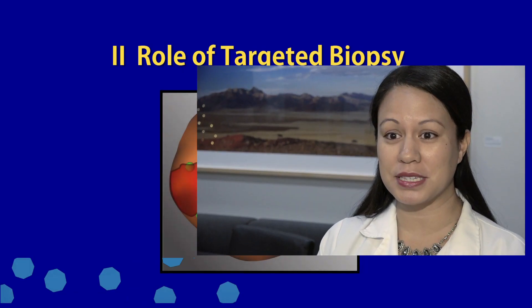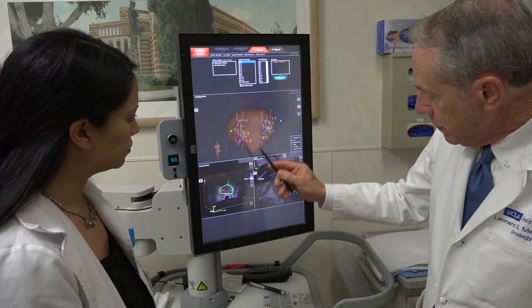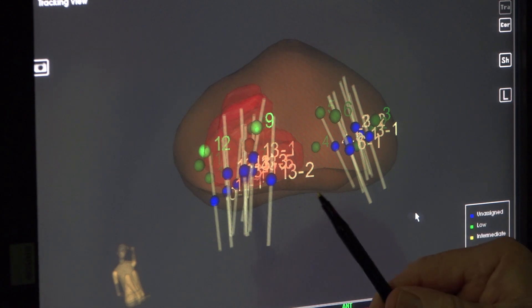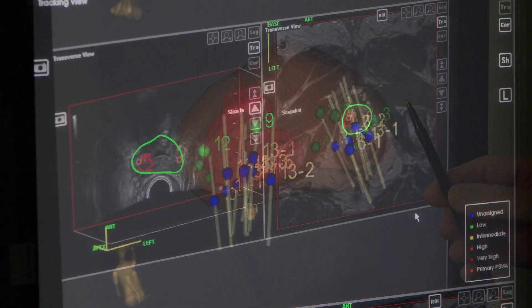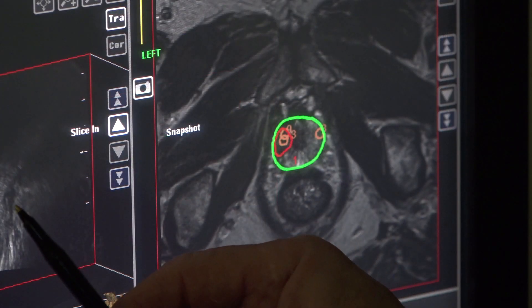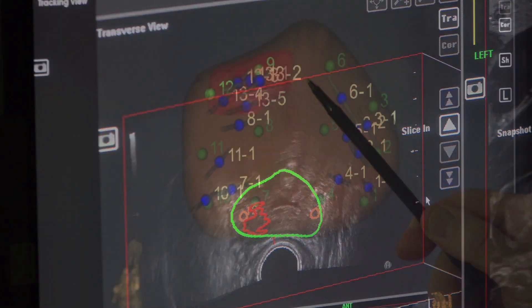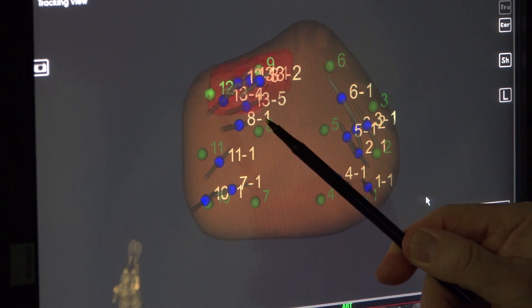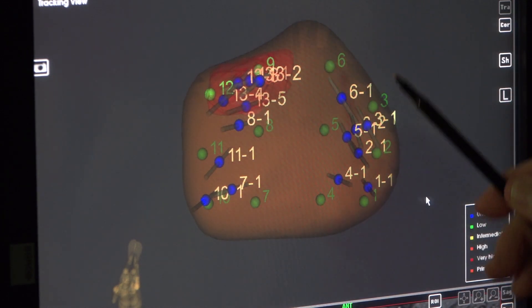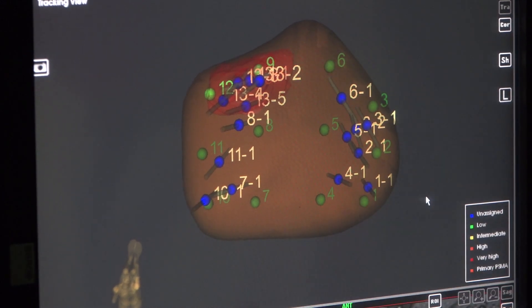Targeted and systematic biopsy of the prostate is performed using an image fusion device. The prostate is visualized with ultrasound, segmented, and an isolated model of the organ is created in 3D. The stored MRI and the real-time ultrasound are then co-registered, which allows for the region of interest or target within the prostate to be visualized within the working model. Both targeted and systematic biopsies are taken and the intraprostatic locations of those biopsy sites are stored in the device. Information from these biopsy sites will then be used in focal therapy planning. Extra samples from the periphery of the lesion can add precision to the planning.